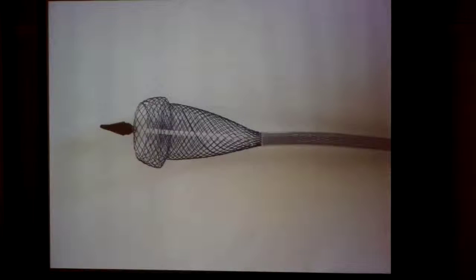This is what a stent looks like when it's fully deployed, and this is the system which deploys the stent. You can see the tube which the stent comes in. The guide wire goes into the green tube, comes through, and you pass the stent over the guide wire. The deploying mechanism opens up the stent.